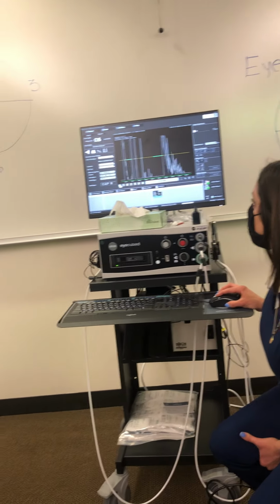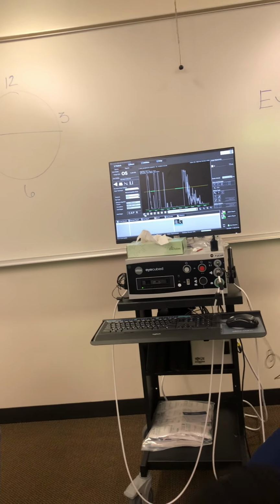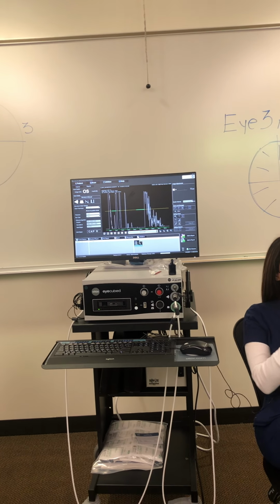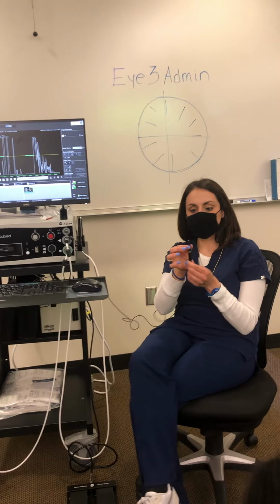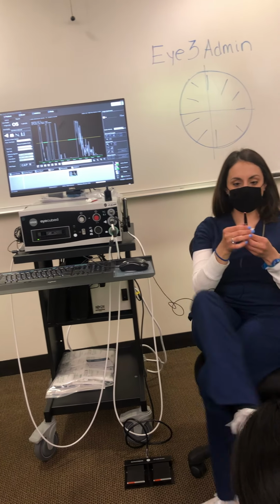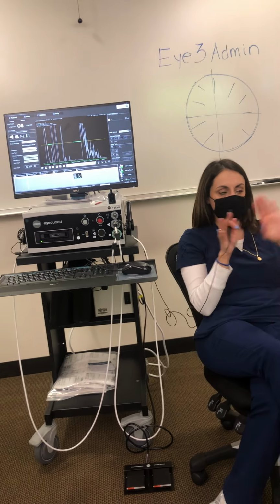From front to back. So the probe is the tapered one, okay, and there's a little red fixation light on here. The reason why the probe is tapered, whereas the diagnostic is kind of broad, is because it's fixed to just go down the visual axis. We don't want anything else.